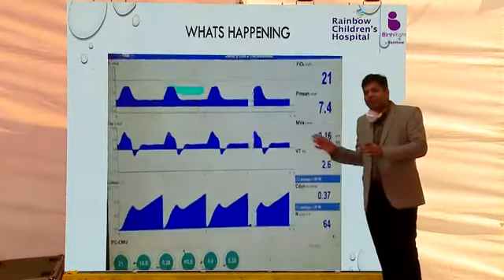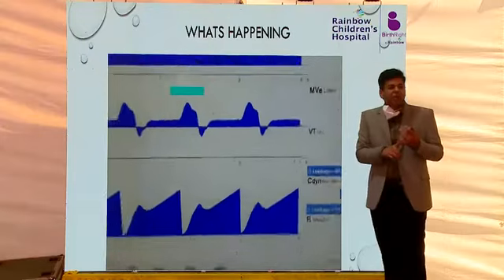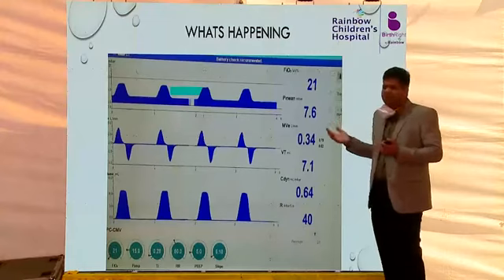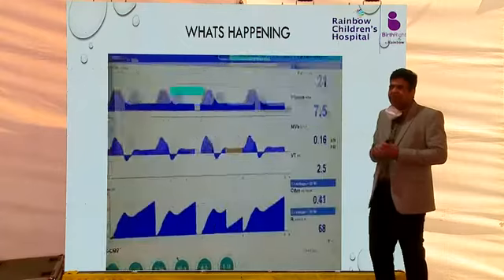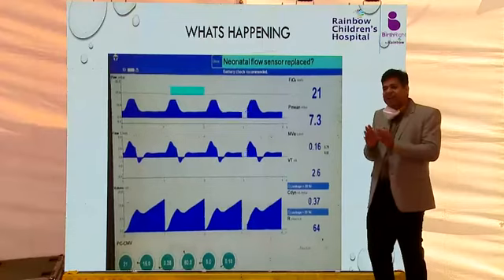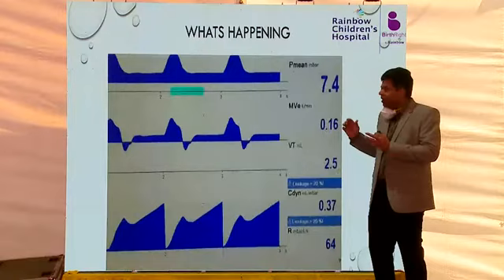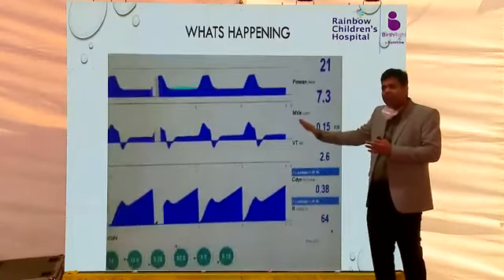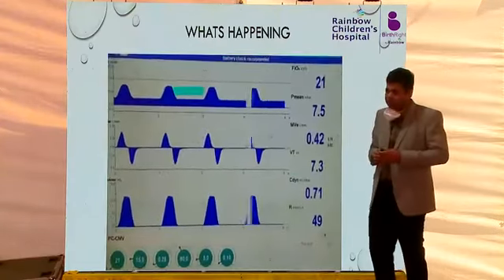Okay. So till now, summarizing the clinical applications, pressure waveform was the mean airway pressure, and you can look at how to increase the mean airway pressure. What was the other application we found in the pressure one? What was the other? So mean airway pressure. In flow waveform, TI should be adequate, long TI, short TE leading to gas trapping. Then the volume one and the flow one, you can look for the leak, and the flow one also will tell you, or the volume one will tell you, whether your tube is displaced or not, right?